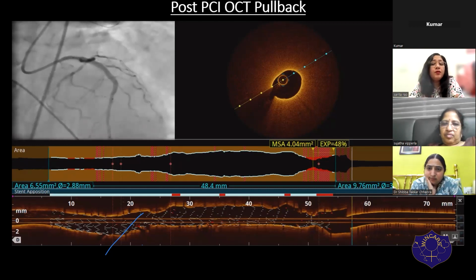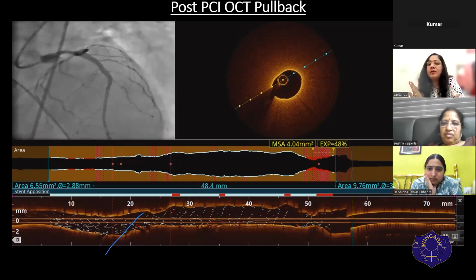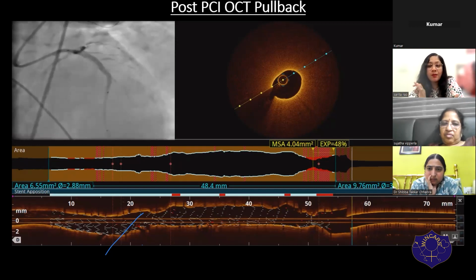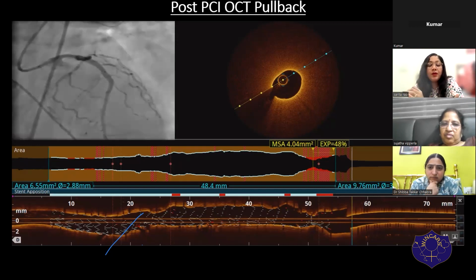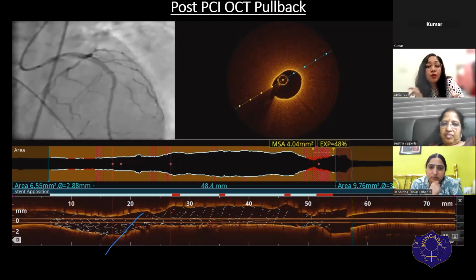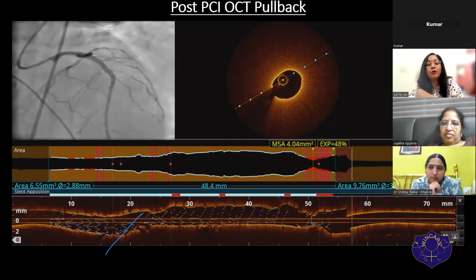This is the difference between rota and orbital. Orbital, literally no slow flow and literally no bradycardia. If you read up about it, orbital atherectomy is associated with literally no bradycardia, and rota is associated with higher rates of bradycardia and higher rates of slow flow.